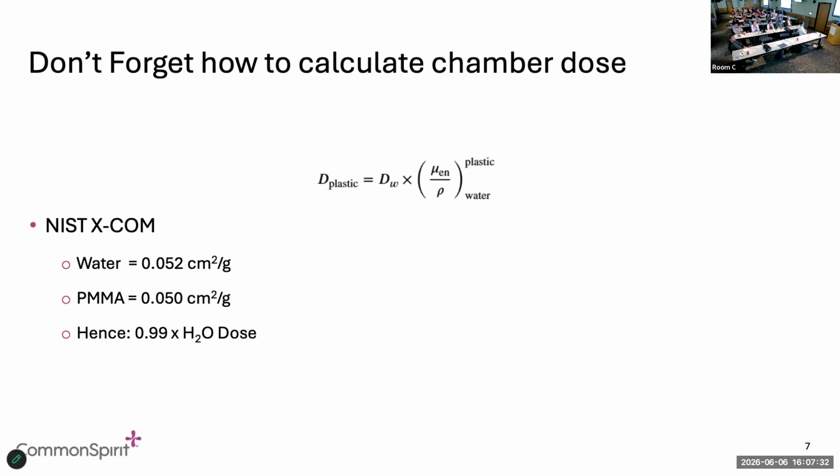I mentioned that there's a chamber hole in there for the multi-plug. So they give you the option of putting the chamber there. So now you're checking, I guess, 2.9 cm from the surface for the ArcCheck. In addition, you can check in the center of the ArcCheck with the chamber, where you have TG51 or whatever.